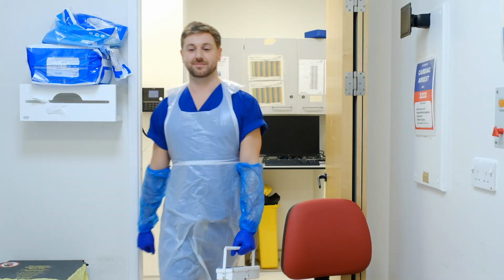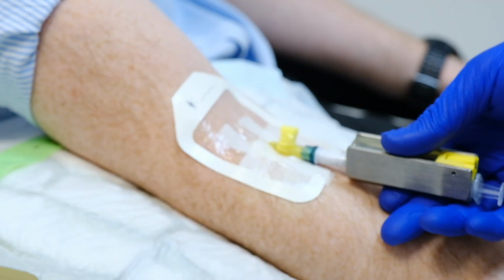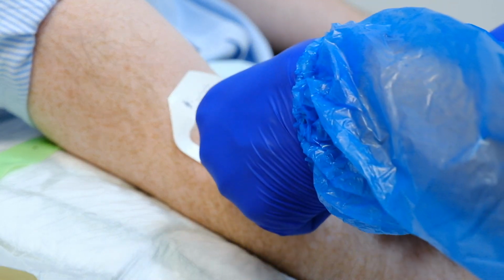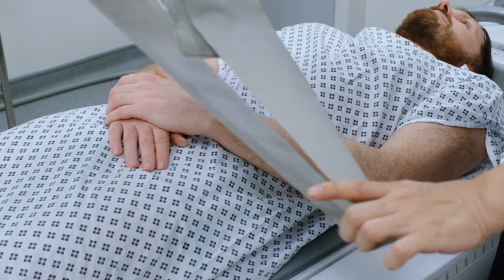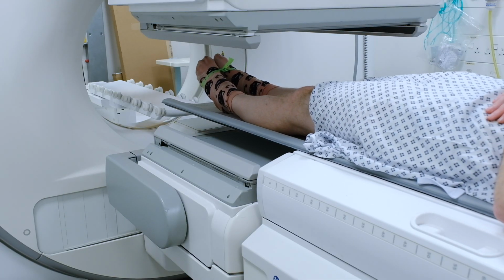After the conversation, we administer the dose intravenously using a butterfly or a cannula. After the administration, the patient needs to wait at least 3 hours before the scan. When the time is up, the patient is asked to lie down on the gamma camera. From there, we position the patient under the gamma camera and slowly the patient emerges while the machine scans the area. After the whole body scan, we may perform additional static images.